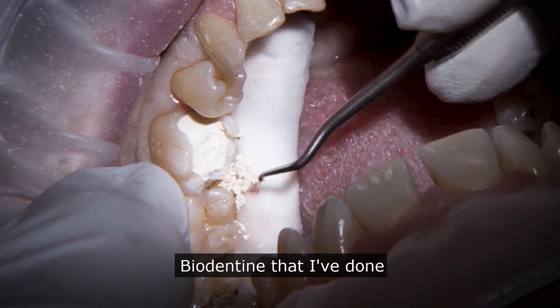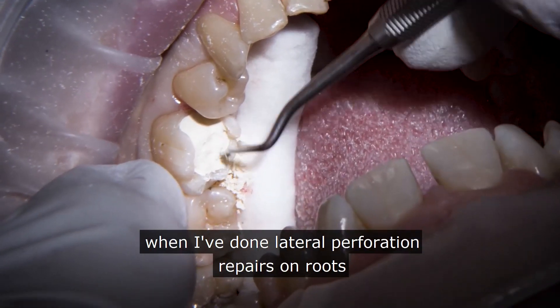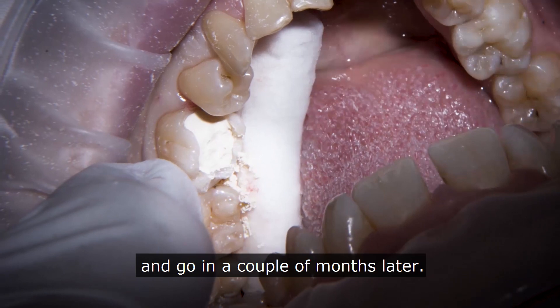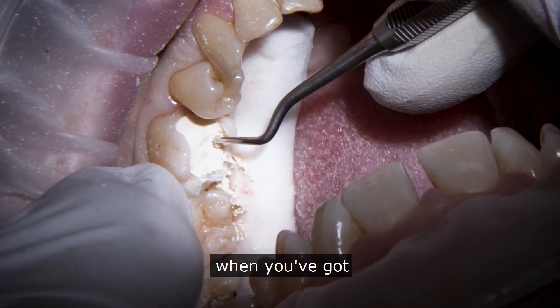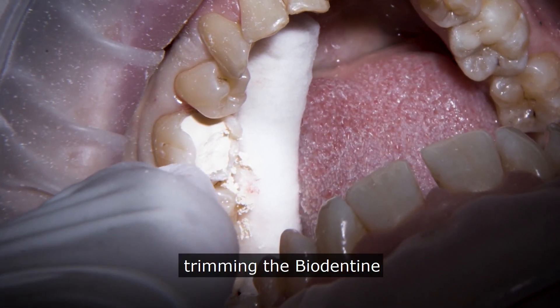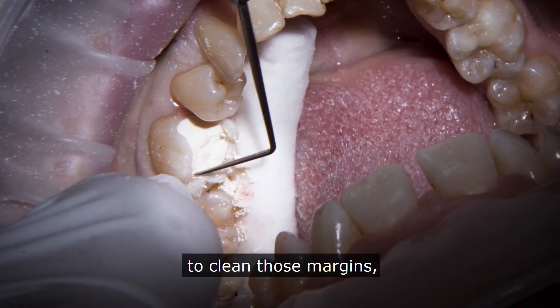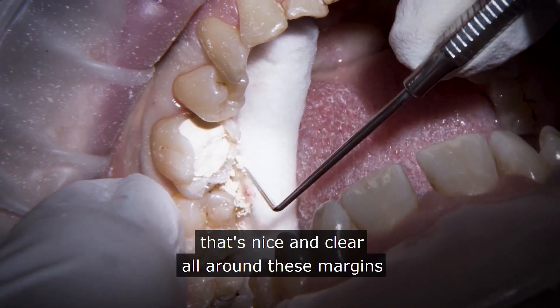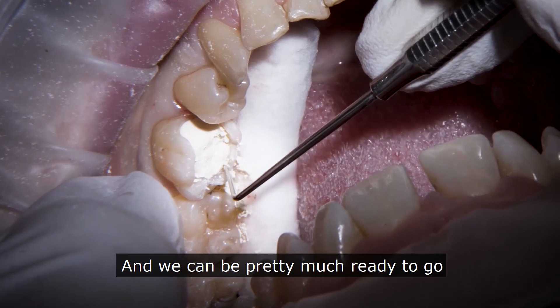Initially, you just haven't got the bond there. This is quite a nice retentive cavity, but when you've got something that's fairly flattened you've just got to be so careful with the way you're trimming the biodentine — that's why I like to get as much shaping as I can. Then I just take the probe around to clean those margins. We've managed to keep it really clear all the way around; I'm happy we've got enough depth to place the filling and we can be pretty much ready to go.